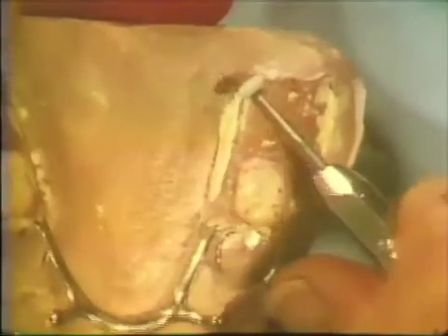Areas of interference are located with articulating ribbon. The adjustments are made with appropriate small stones. When the adjustments are complete and the occlusal stops once again firmly seated, the appliance may be removed from the curing cast.